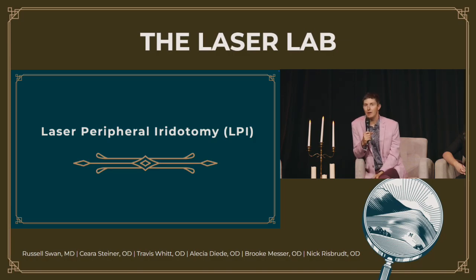Yeah, so if somebody has a really fibrinous posterior capsule, and again, the most common time we'll see this is somebody with a large history of really bad uveitis, or most commonly somebody who's had a really bad retina history. So maybe they've had multiple retinal detachments, they've had silicone oil placed, the silicone oil is removed, but they'll oftentimes get this kind of leathery, fibrotic posterior capsule. The biggest thing in that setting is you're often going to have to increase the power of the energy, and you're going to have to increase the number of spots that you're doing, and you'll oftentimes have to do them closer together. But the bigger thing is just you're almost always going to have to increase the power.